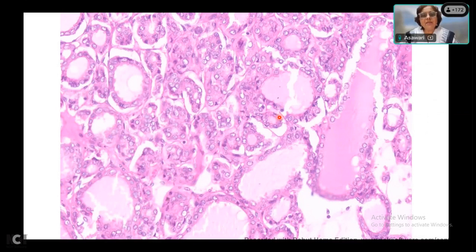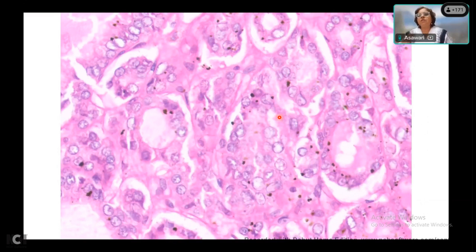So can you describe that? Who was describing? Apurva? Yes, ma'am. What do you see here? What have you noticed of all these features? Yes, ma'am. There's nuclear clearing. Then grooving is also there, ma'am. In the next slide. Yeah. So just enumerate all the positive points, what Dr. Swapnil just taught you and what you have noticed in this slide. And there is nuclear clearing, overcrowding. And start from the beginning, Apurva.